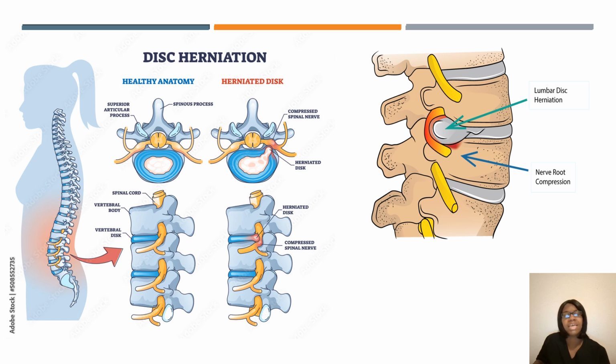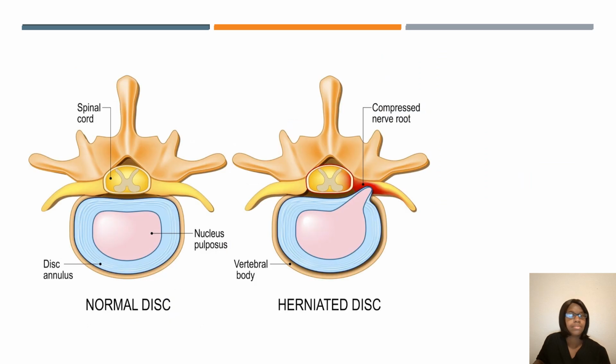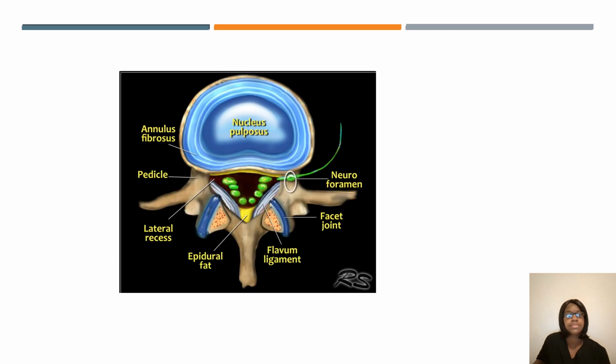And this is pathology, like an illustration of how a normal disc looks, what you would see if you saw a bulging disc, herniated disc. More pathology for you to review. Just know the difference between a normal disc, how it looks, versus a herniated disc. And whenever you get to this point, you can just pause the video and just review your anatomy like this.